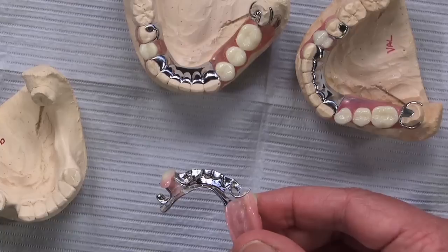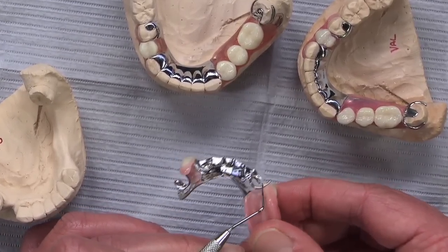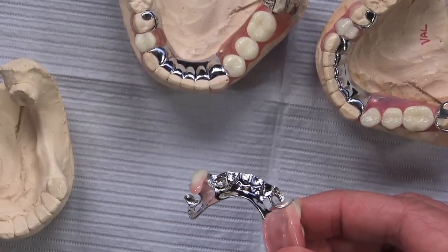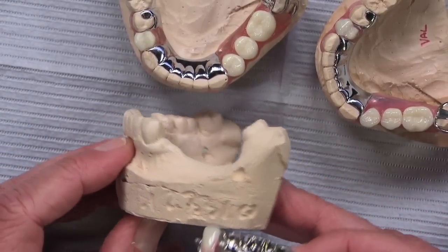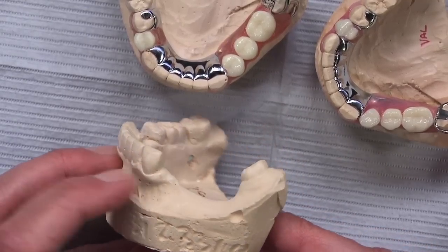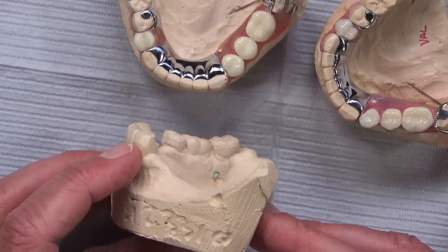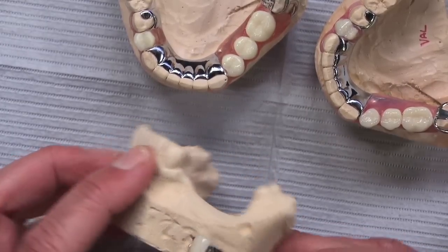And you'll see now that we have the clasp right along here. So it is going to engage on the distal of that cuspid. And that can work if, in fact, we have that undercut on the tooth itself. Or we can create that undercut. Or perhaps this tooth needs a crown. And then certainly our combination department will build that undercut into the crown so that the clasp will fit right into that and we're able to do it.